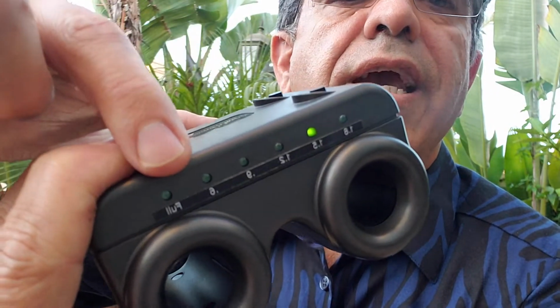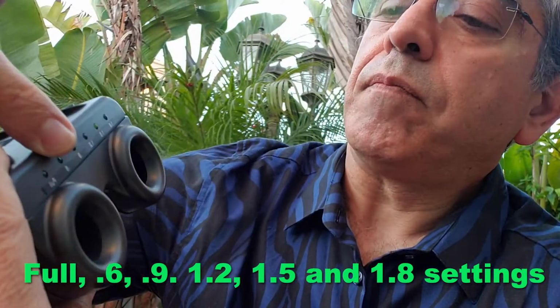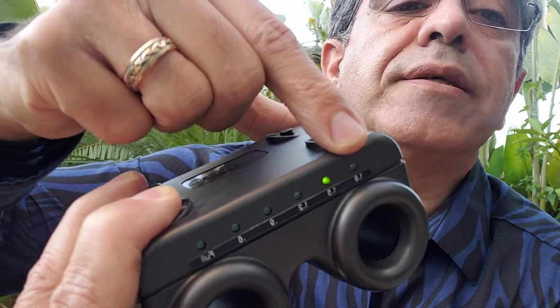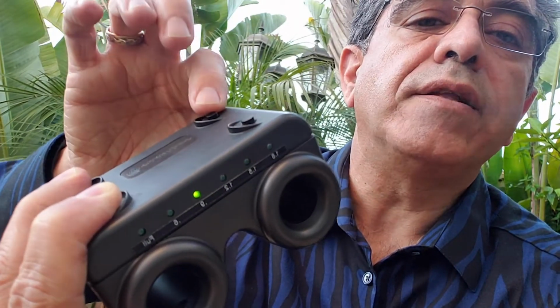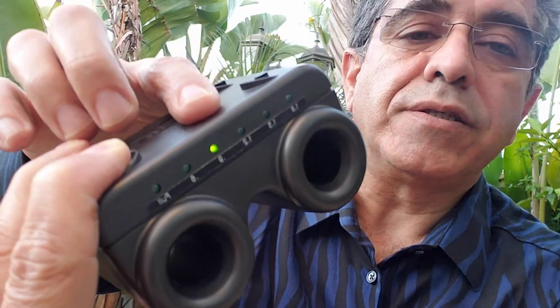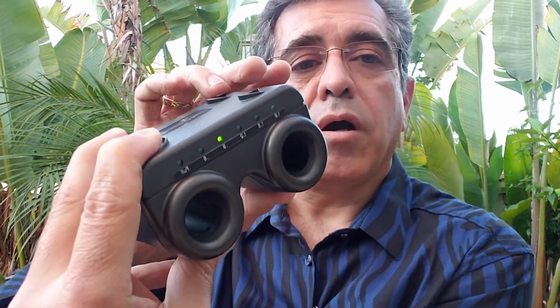So you can see the scale, but it says full, and then there is the level 0.6, 0.9, 1.2, 1.5, and 1.8. These are the same levels as neutral density filters. And you can actually keep going until you find the right level. So once you have decided this is the correct level where there is no APD present, then you can record it on the patient's chart. For example, in this case, it would be 0.9 log units APD.